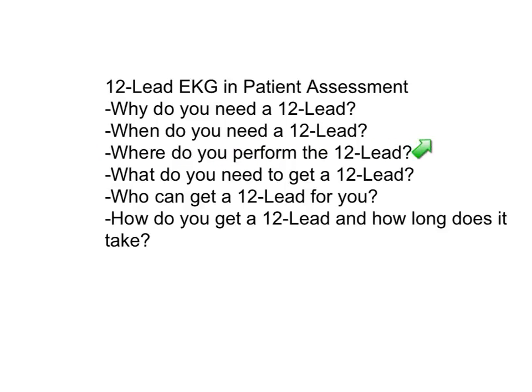Where do you perform the 12-lead? It should be wherever you need it. You can certainly do one quickly in the house. If you begin treatment in the house, you can do one in the ambulance. When the ambulance is moving, you're going to get a little bit more artifacts sometimes, a little bit more motion. But again, you can time that and work on getting your 12-lead when you come to a stop, when you're going to listen to lung sounds, or when you're going to get another blood pressure.